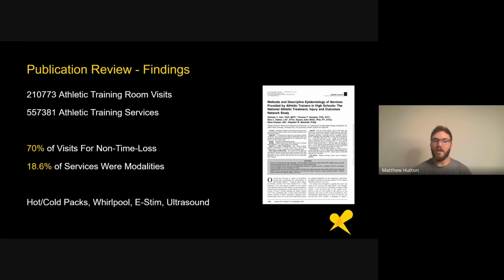I think everybody had a combo unit in the high school setting. Everybody's got stim and ultrasound. Everybody's got some kind of metal tub that you can fill up with either hot water or cold water, and you can probably use the jets to get rid of a thermic barrier. And everybody's got hot packs and ice bags, but that one caught me by surprise. So in this paper, they have them rank ordered based on the frequency, and you can see which services are being utilized the most. But that was the order of the most common modalities.